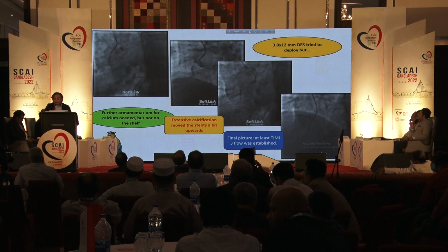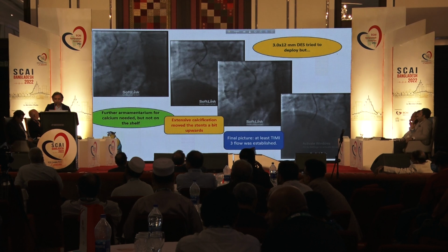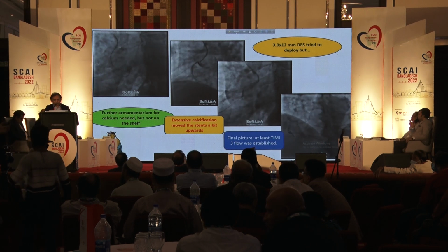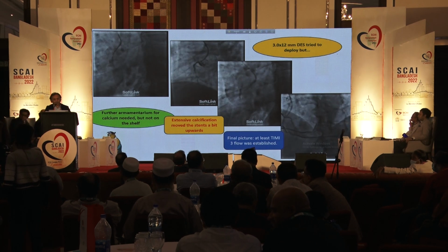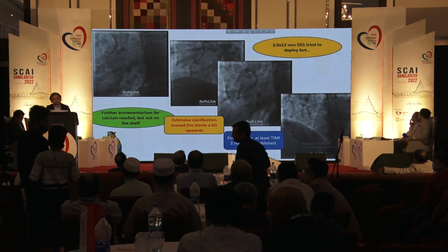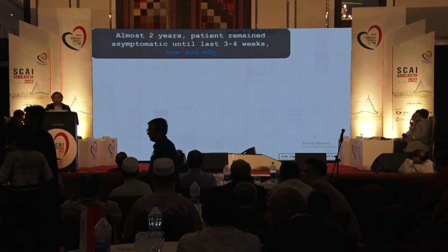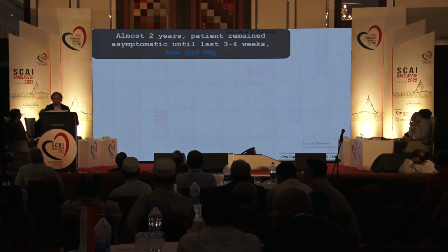So then a 3 into 12 millimeter stent, a small stent, was tried to deploy, but you see that extensive calcification beyond the occluded segment has moved the stent a little bit upwards. You can see here the final picture, and the operator stopped there, but at least TIMI 3 flow is there. Almost 2 years, the patient remained asymptomatic until the last 3 to 4 weeks.